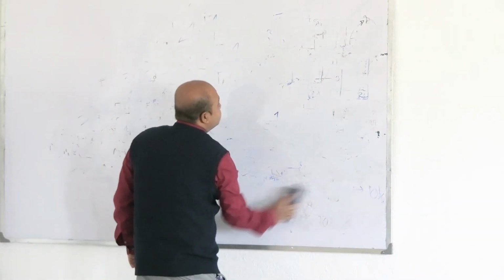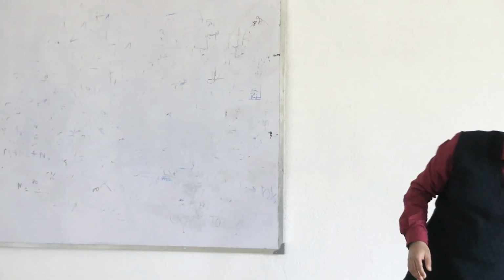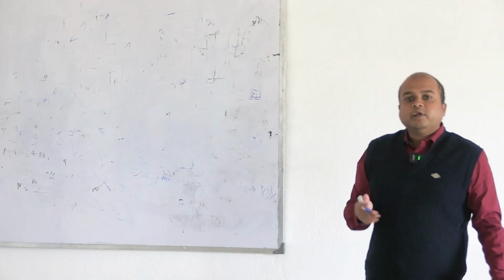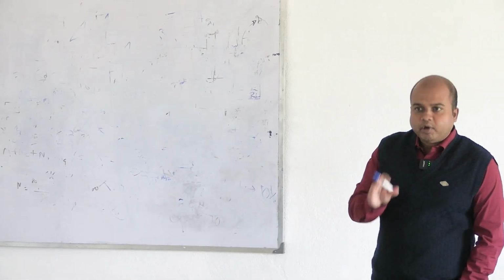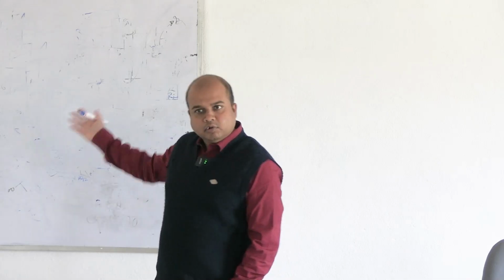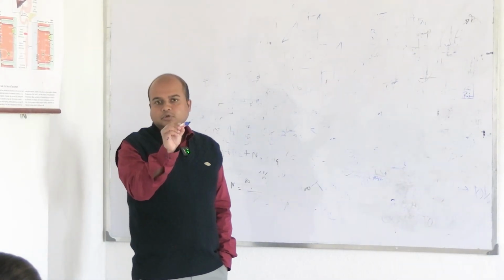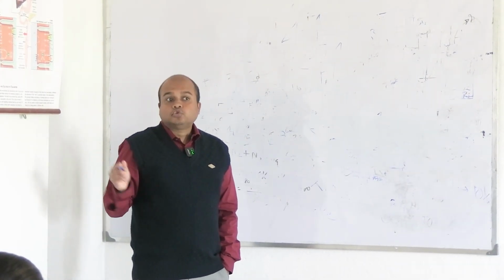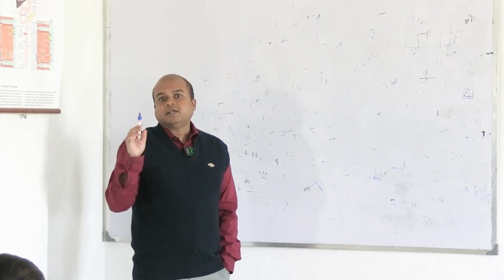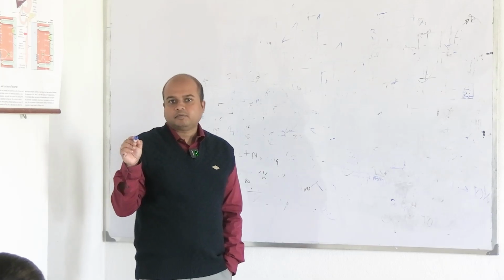So, this is the difference, but one thing, okay, I should not have rubbed it off. Anyway, you will understand. If you have understood it up to this point, actually we are counting how many cells in RBCs? We are counting the medium squares. Actually, are we counting the medium squares altogether? The small squares. So, better to write it as, although this will be sufficient if you write like this, actually we are counting the small squares, small square number 1, 2, 3, 4, 16. So, what is the length of one small square? Small RBC square. Each small RBC square.